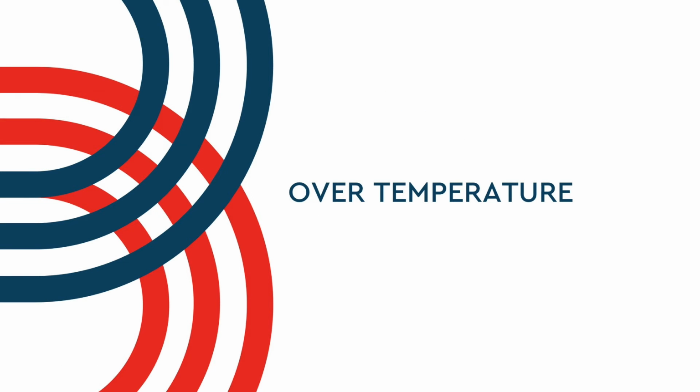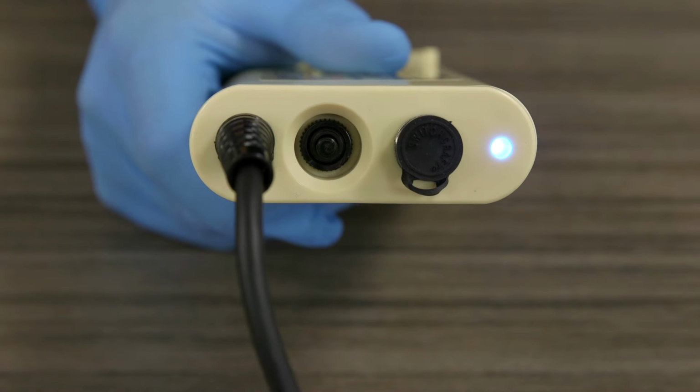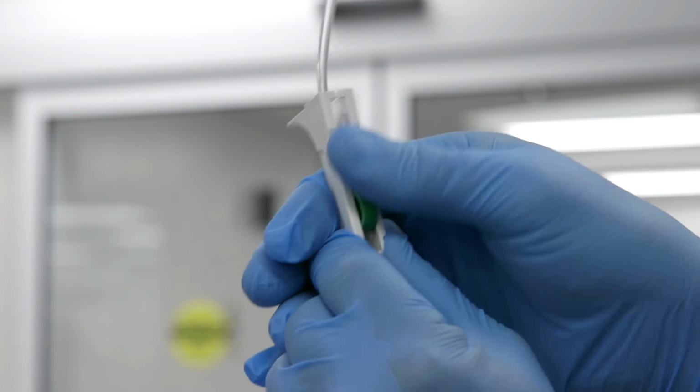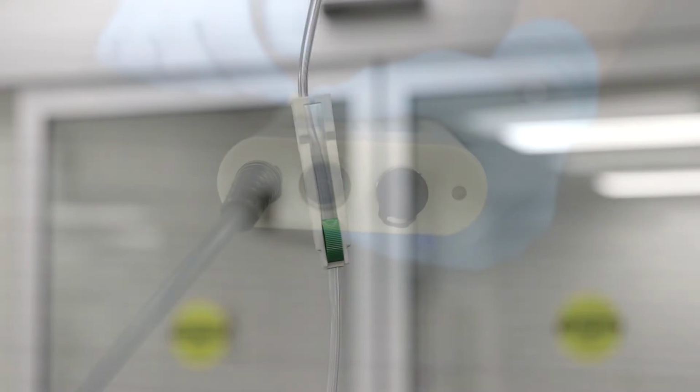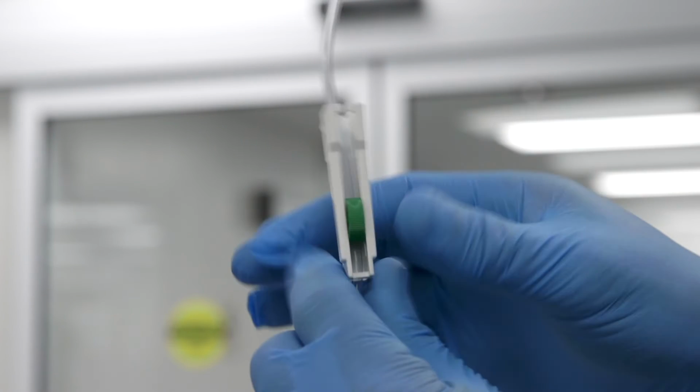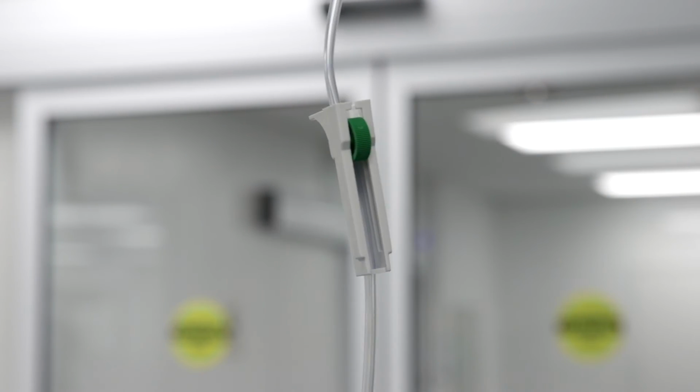If the system detects an overtemperature, the system will stop heating, blue and red LEDs will flash, and an audible alarm will trigger. An overtemperature alarm may be triggered by repeatedly stopping and restarting infusion during high flow conditions. To resolve the condition, clamp off the line and repower the system by turning the unit off and then back on. Unclamp the line to restore flow.